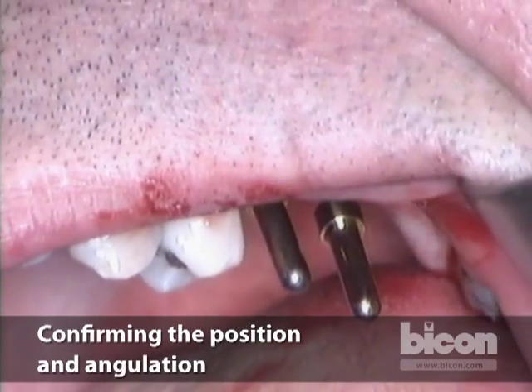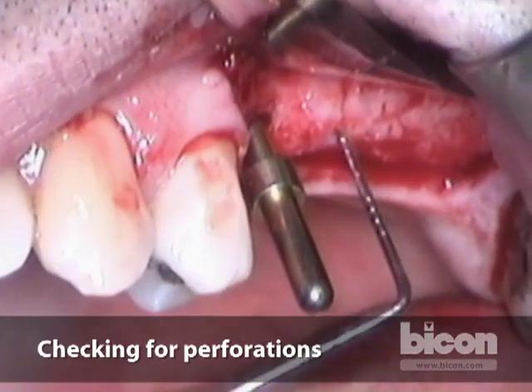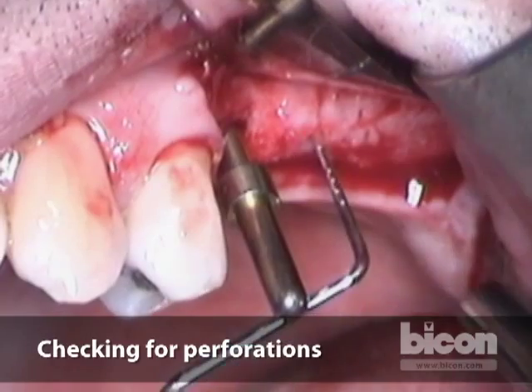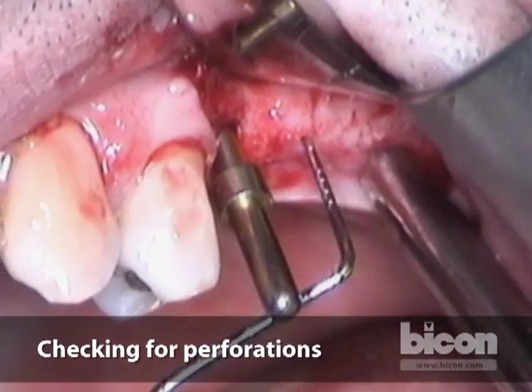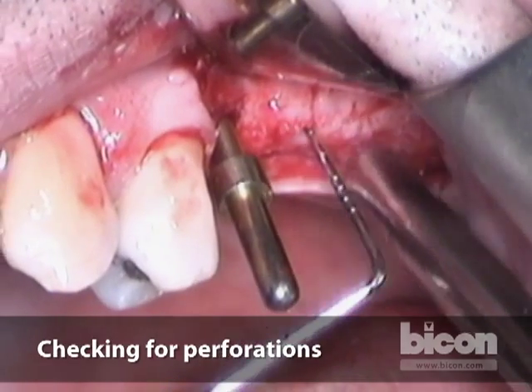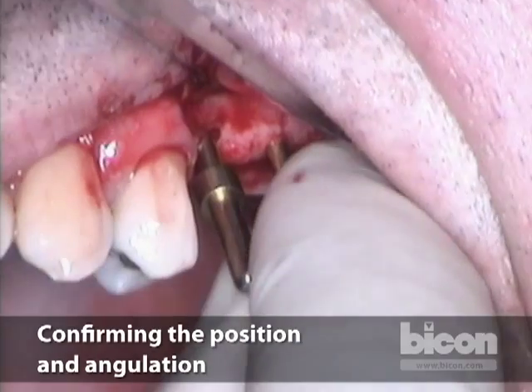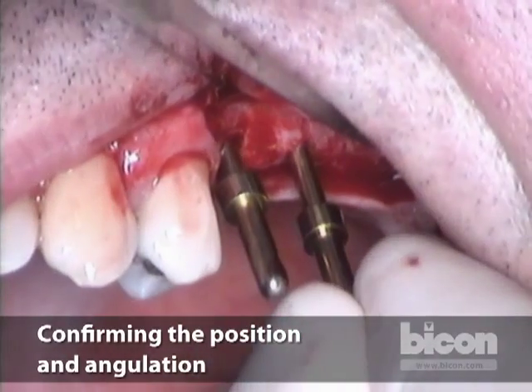Before we proceed, I will take a perio-probe and make sure that I have not created an inadvertent perforation. I don't have a perforation. The osteotomy is at about four millimeters of depth at one end and three at the posterior end, which is a good thing. Checking the parallelism of the two — I think it's acceptable.